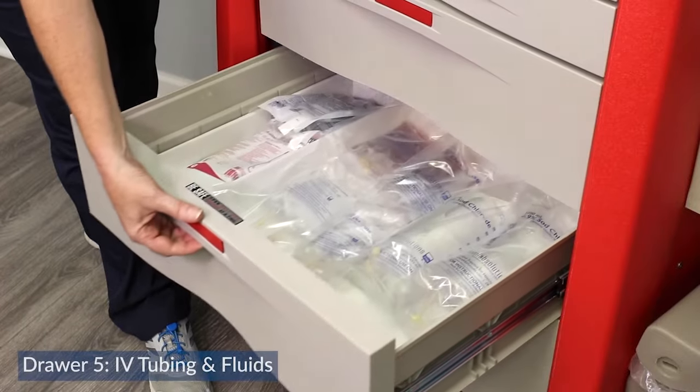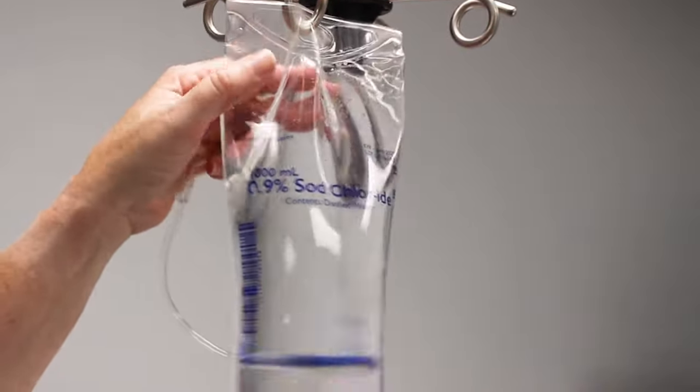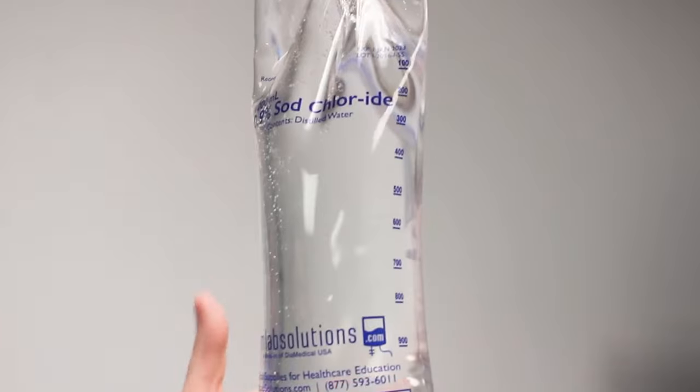The fifth drawer contains all of our IV fluids and IV tubing, so we can administer fluids especially when the patient's blood pressure is low.